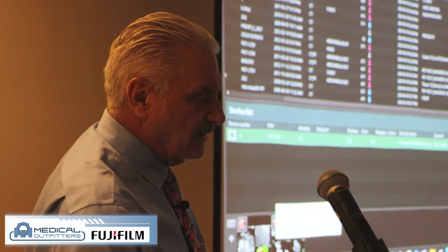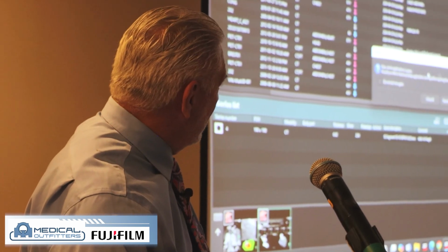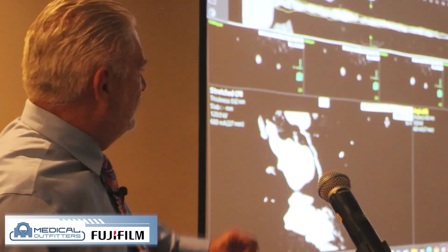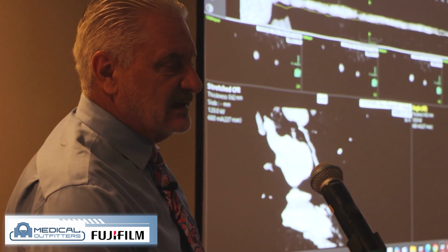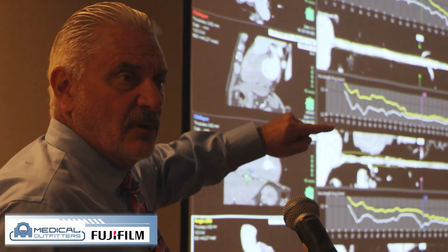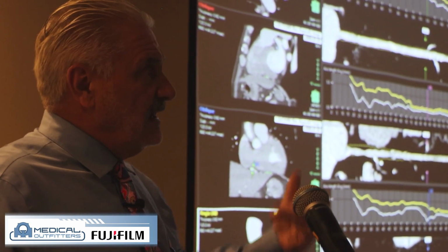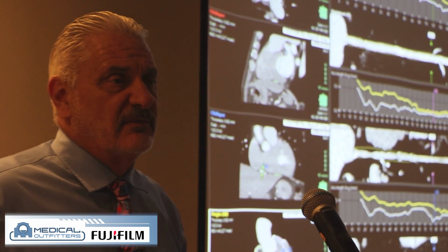So if I come back over here to this thumbnail down here in the bottom, and I double click on that, it's going to open that study exactly off to where we were using it before. So when I save this for a radiologist, I save it with all three of the coronaries so that they can go and rotate them all. They can go evaluate them for stenosis. And I also save them the other image where they can rock the images back and forth.